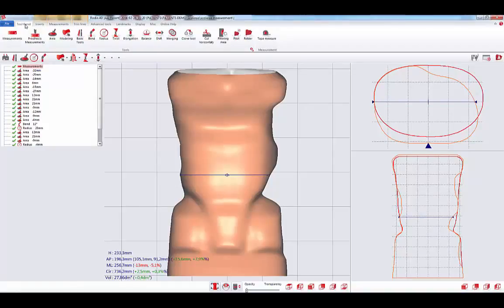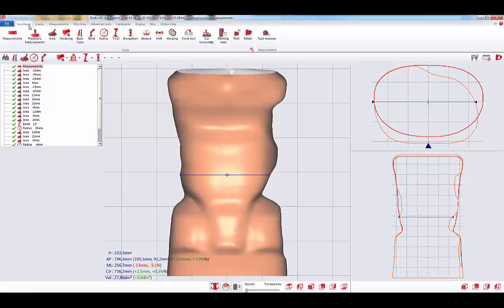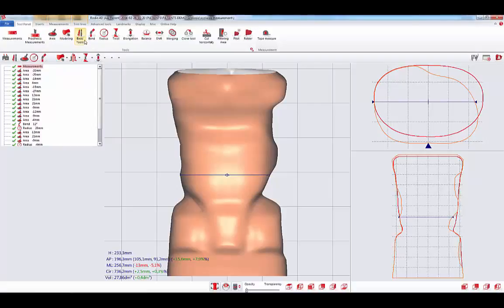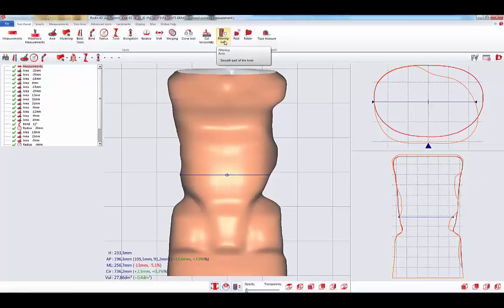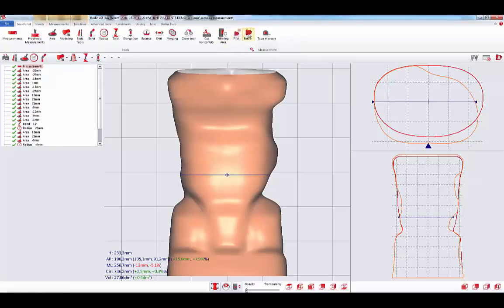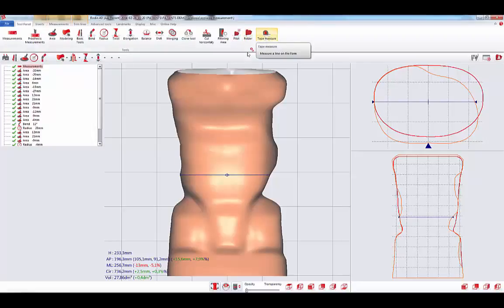From the second tab, the Tool Panel tab, you can access all the common tools such as the measurement tools, the area, modeling, basic tools, bend, radius, twist, elongation, balance, shift, merging, clone tool, cut horizontally, filtering area, two new tools in Rodin 4D Neo, pilot and the folder, and the tape measure.